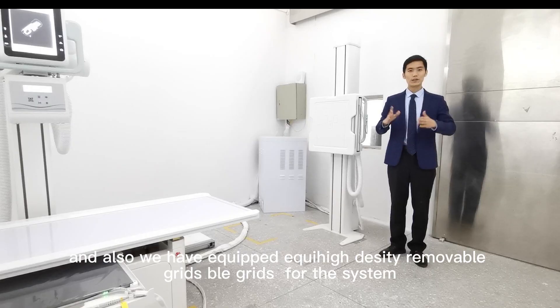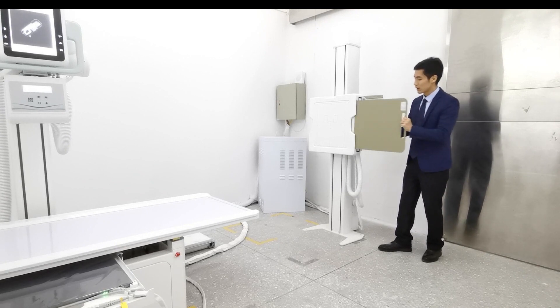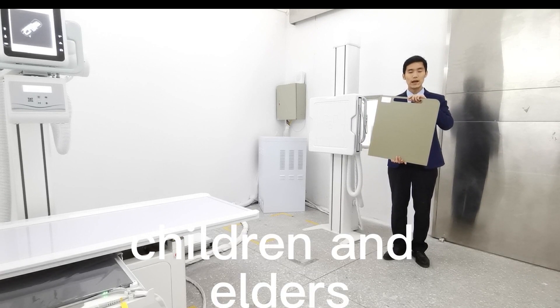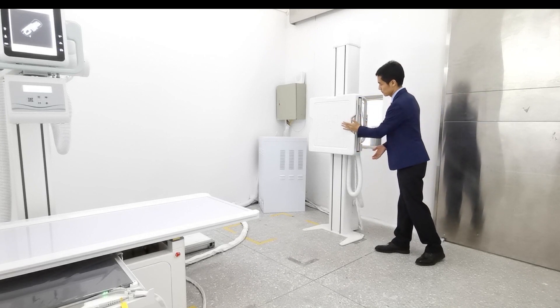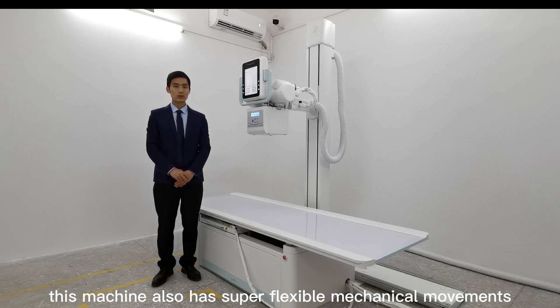We have also equipped a removable high-density grid for this unit. This is very convenient for vulnerable patients such as kids and elders. Besides the top-level X-ray equipment, this machine also has super flexible mechanical movements.